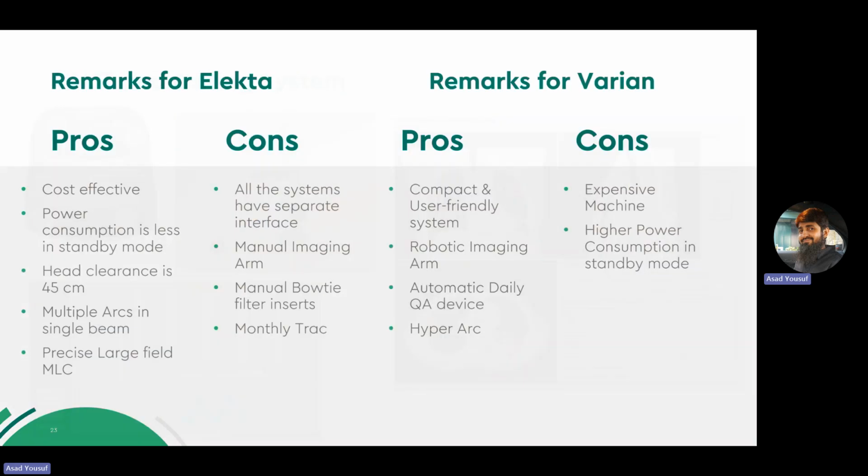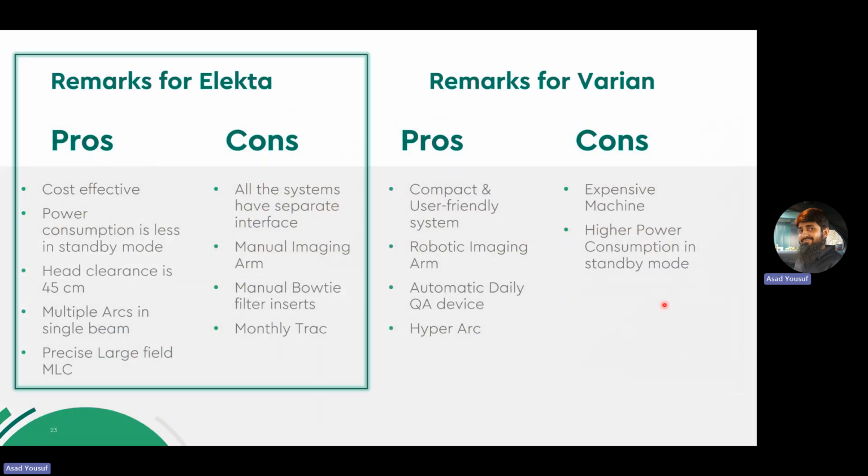Remarks for the Elekta, pros and cons. So it's cost effective, power consumption is less in standby mode, head clearance is about 45 centimeters, and multiple arcs in a single beam. That's a very good option for fast treatment delivery, with precise large field MLCs.